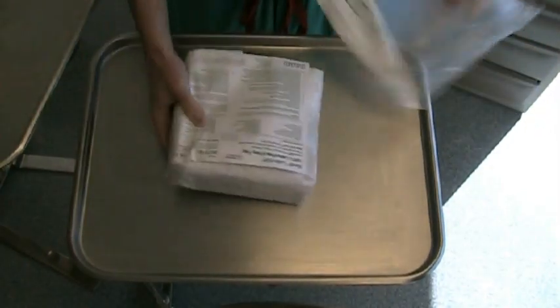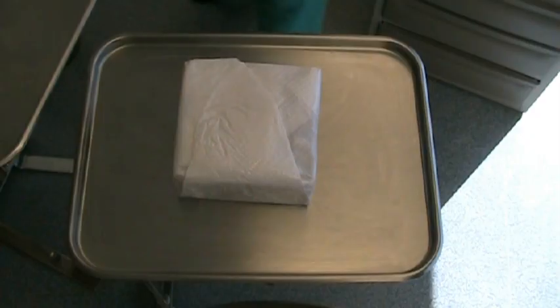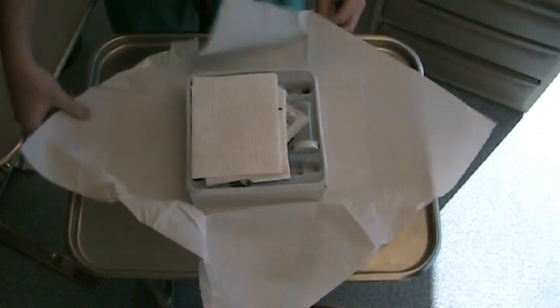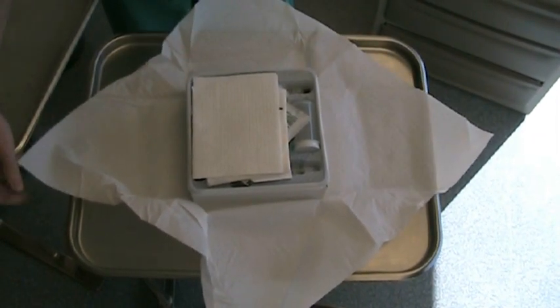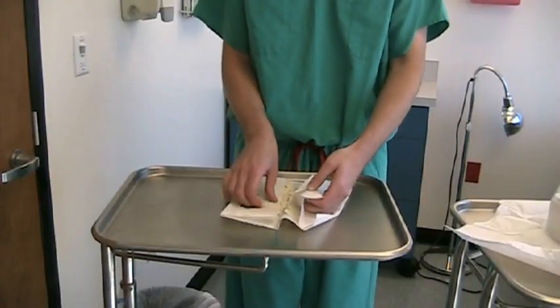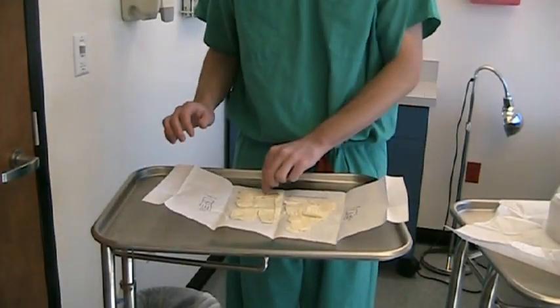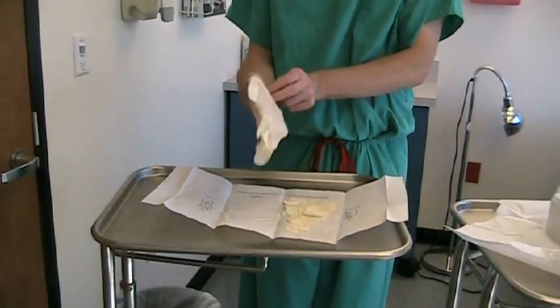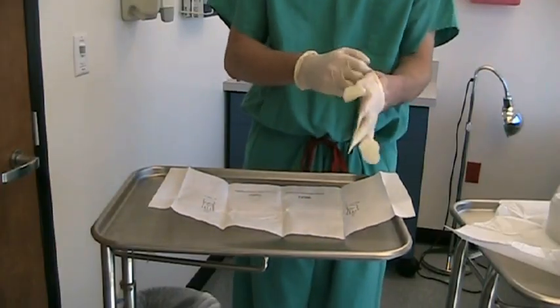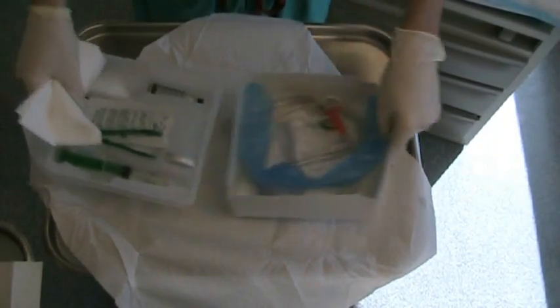Begin by opening the catheter kit onto the tray. Apply the gloves included in the kit in sterile fashion. The small tray is then removed from the larger box.